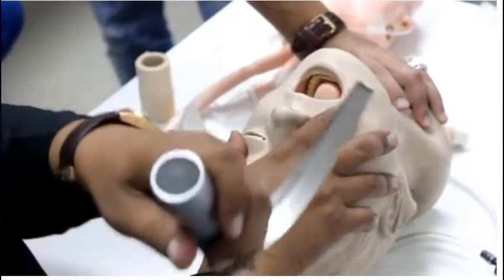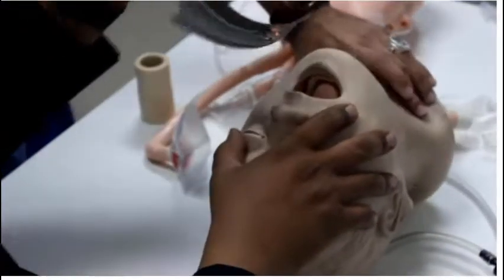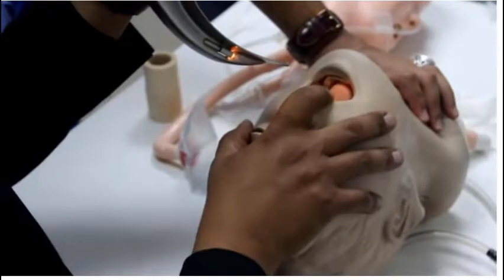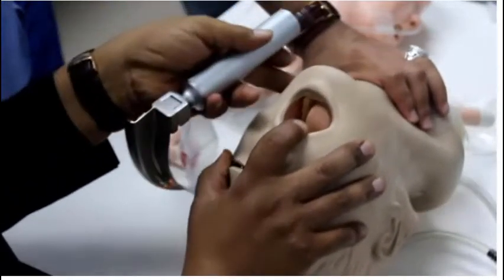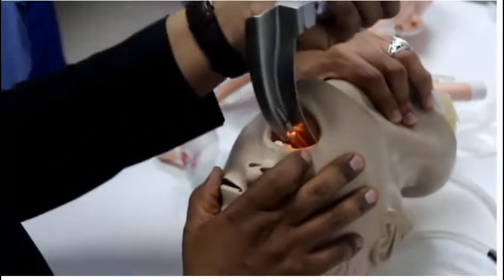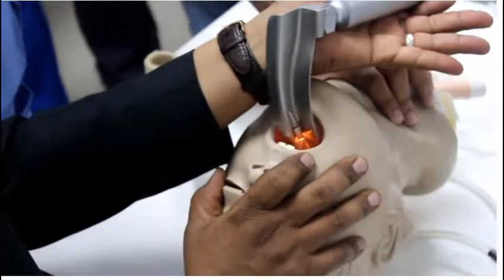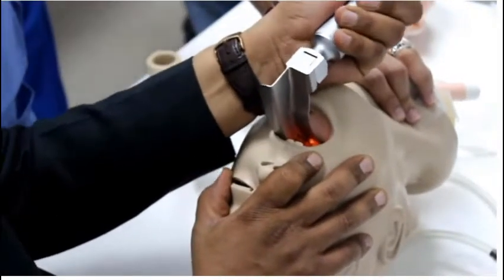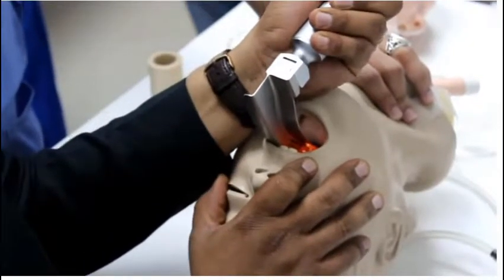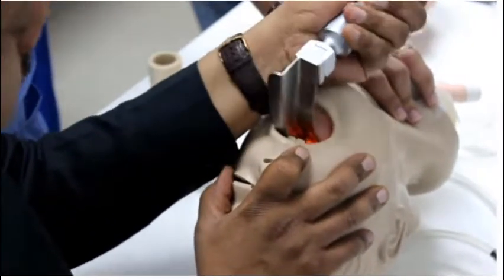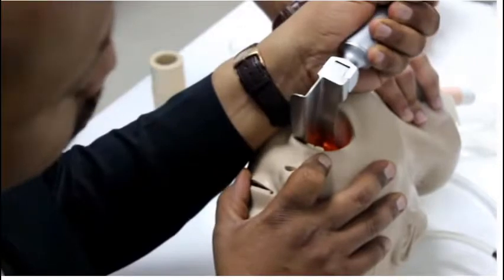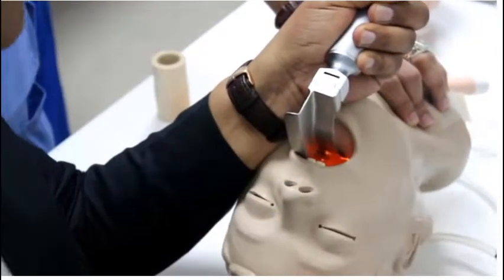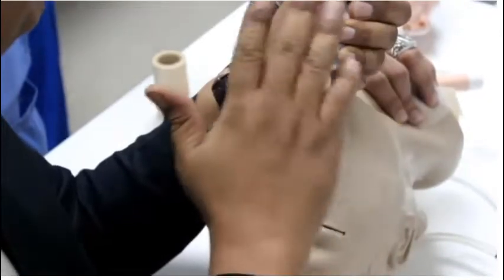You have to put the laryngoscope in your left hand and approach your patient on the right side. You have to push the tongue from the right side to the left and then descend down. The key structure here is the epiglottis. When you catch the epiglottis like this, you have to keep the laryngoscope in front of the epiglottis. Because this is the curved type, this is the Macintosh type.